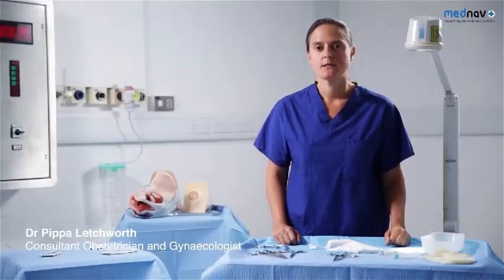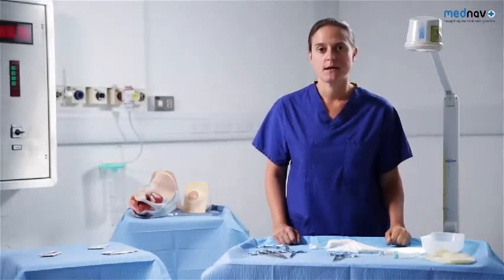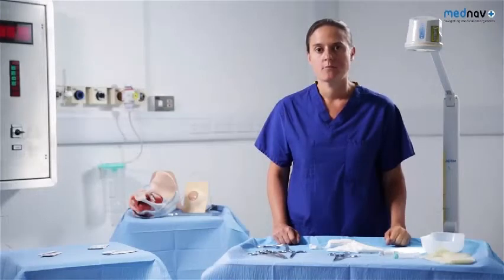During this session, you'll be reminded of the normal anatomy of the perineum. You'll be taught how to perform and repair an episiotomy, and repair of second, third, and fourth degree tears.